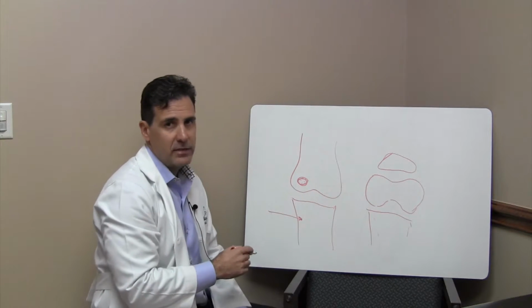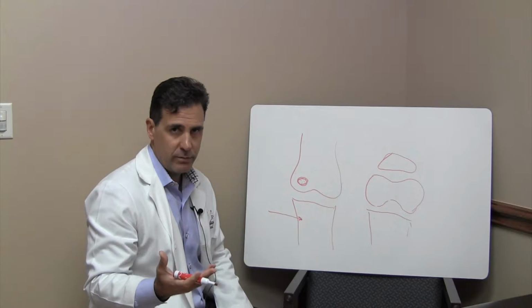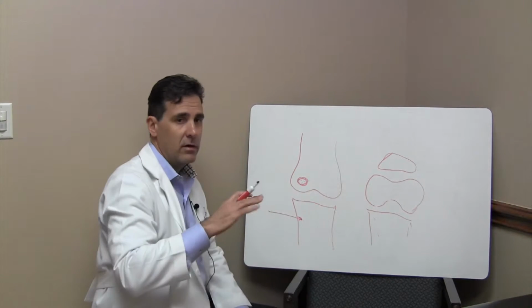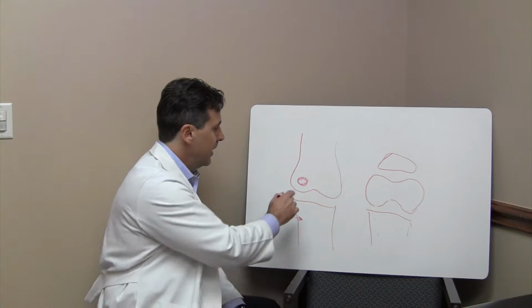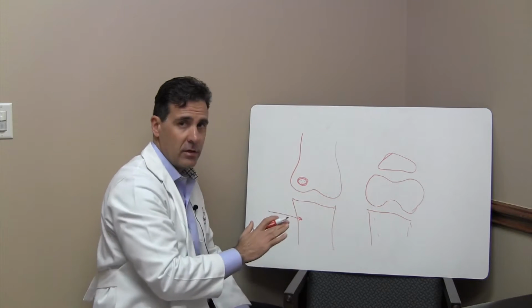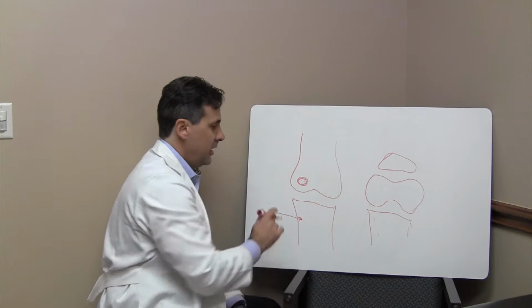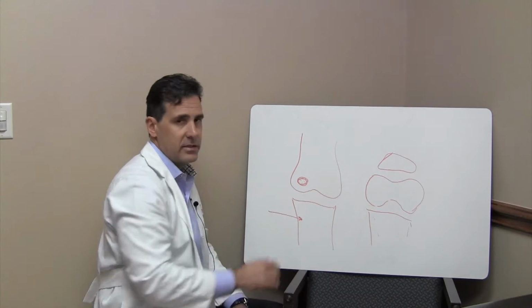and then we lay it into that defect. Okay, so now you've got cartilage cells mixed with stem cells, in addition to little drill holes that are actually little tunnels where more bone marrow is coming out. And then afterwards we put a glue type of surface, called fibrin glue, on top of that. You're almost filling a pothole, and that creates a nice surface.